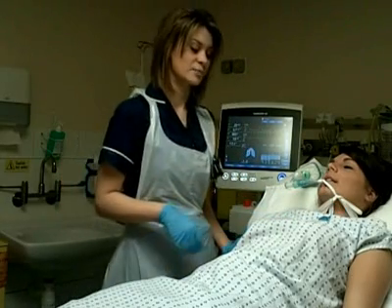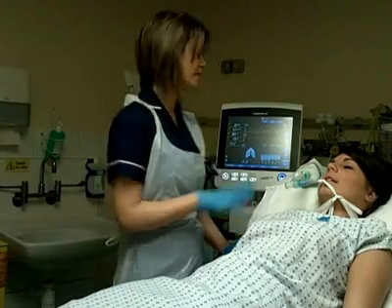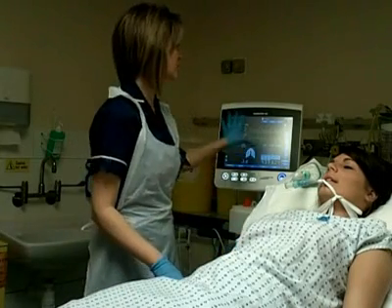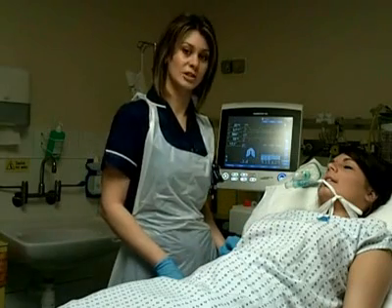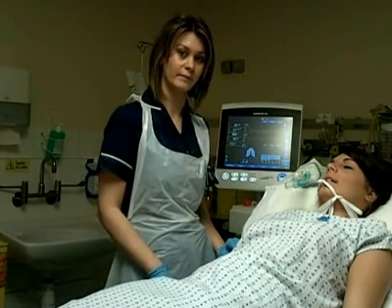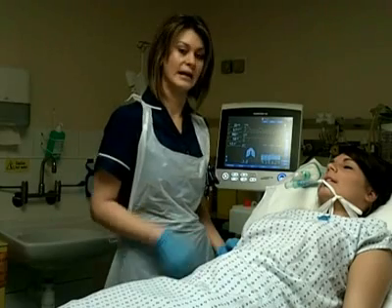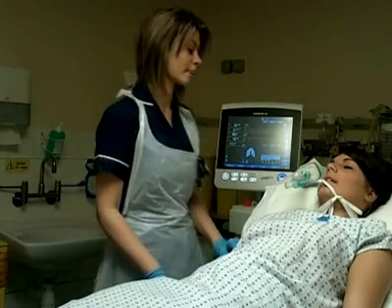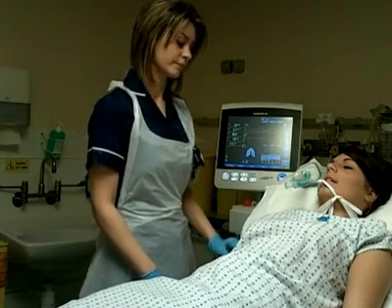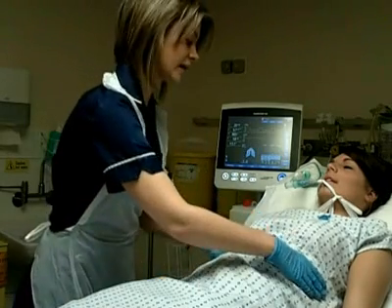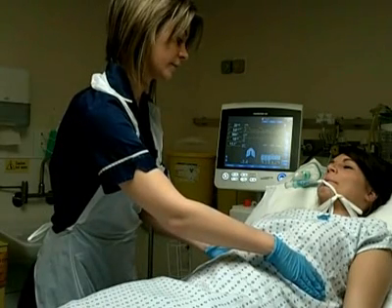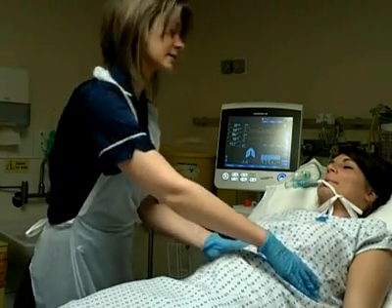Next, we look at the patient's breathing pattern and what mode of ventilation they're on. This patient is currently on full control ventilation. We want to assess the rate, rhythm, and depth of breathing, and make sure they're not using any accessory respiratory muscles. The respiratory rate is good, and I can check that the lungs are expanding equally — which they are.